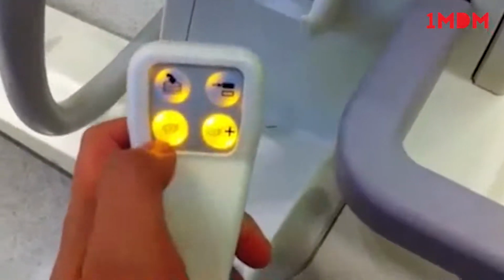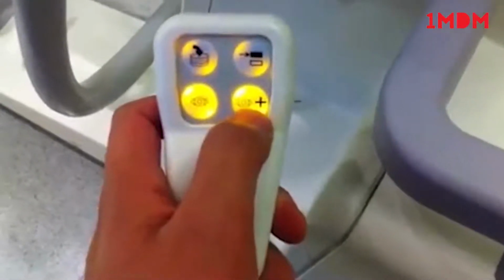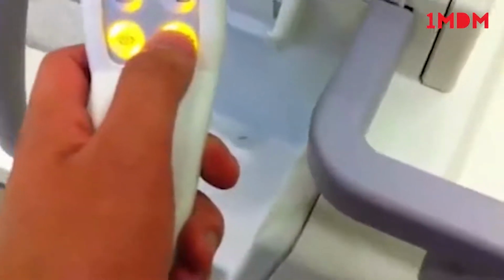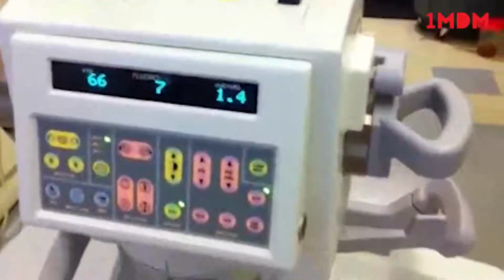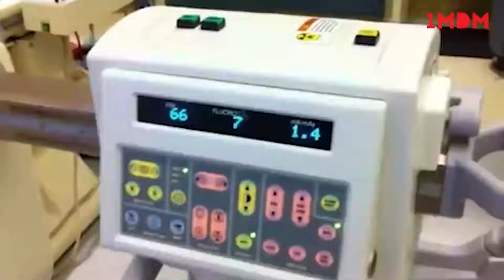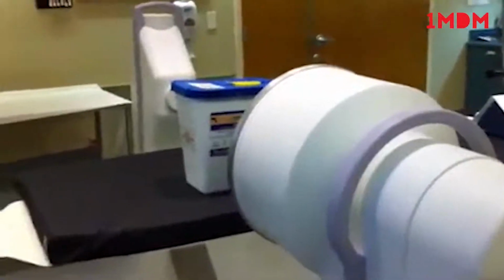Okay, and just quickly, briefly, you have your remote here. This is the save. This is the fluoro, and you need this on the remote handle, of course. You don't want to be able to press it here. You have the boost function, which temporarily can raise the mA much higher than its normal operating mA, like for instance, 12 mA or 16 mA. Standard here seems to be anywhere from 1 to 6 mA. This is the normal operating mA on this machine, typically speaking. And of course it depends on what the patient's habitus is.